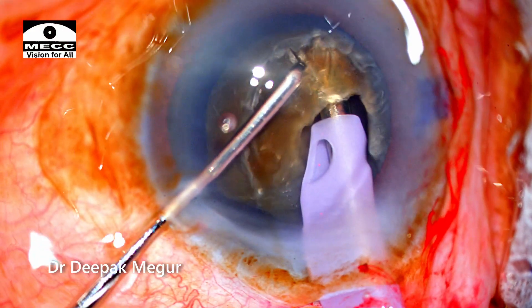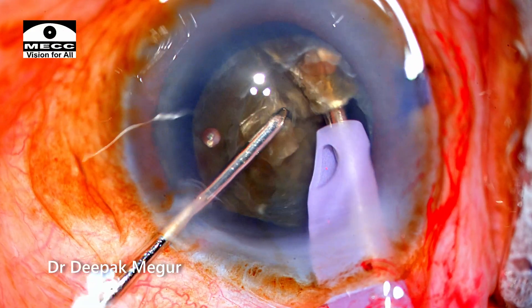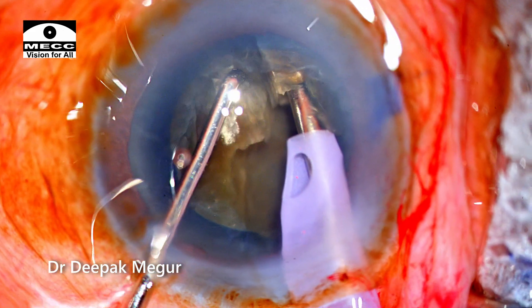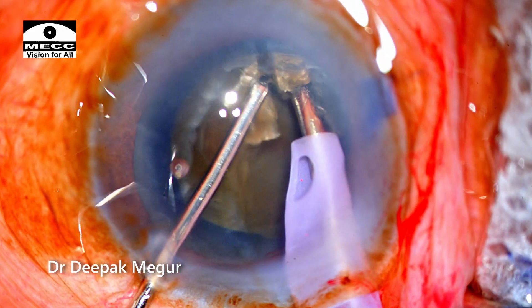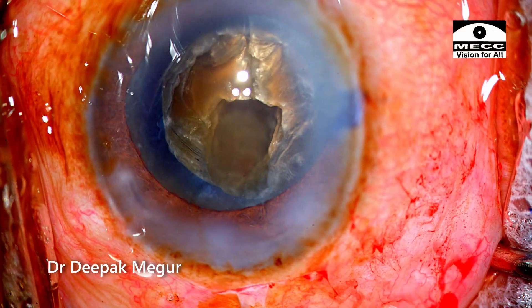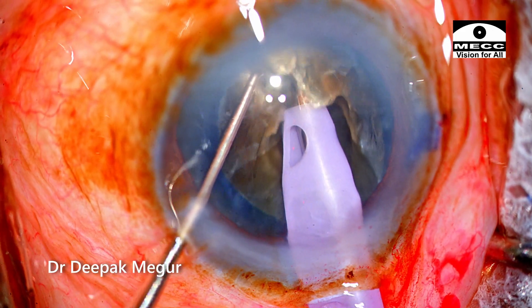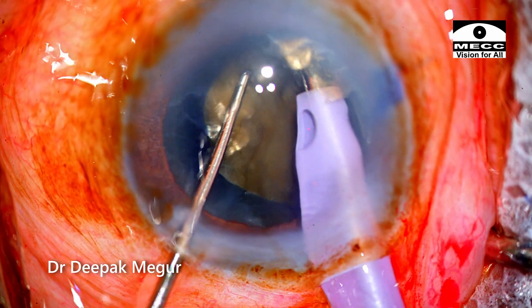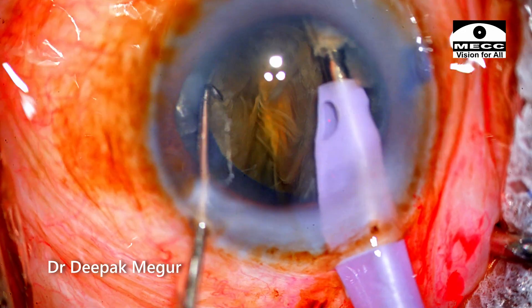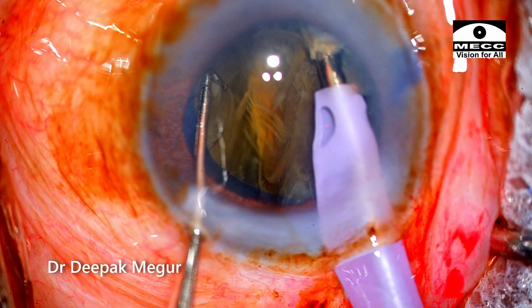The tip is buried but I am finding it difficult to get a deeper crack. Only the superficial part of the nucleus is cracking while the deeper part isn't budging. I come out, re-inject viscoelastic, then grip the nucleus again and repeat the chop and lateral maneuver. This time I got a deeper crack, but the posterior plate is so thick it is still refusing to separate.